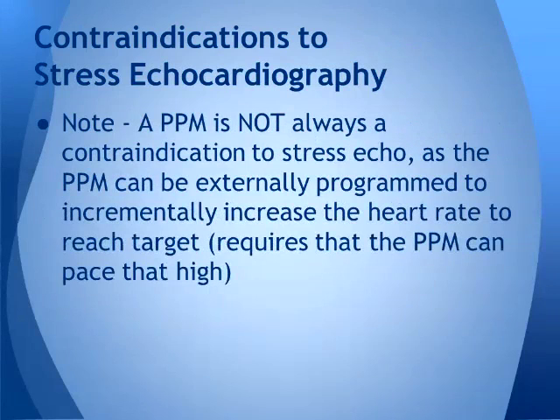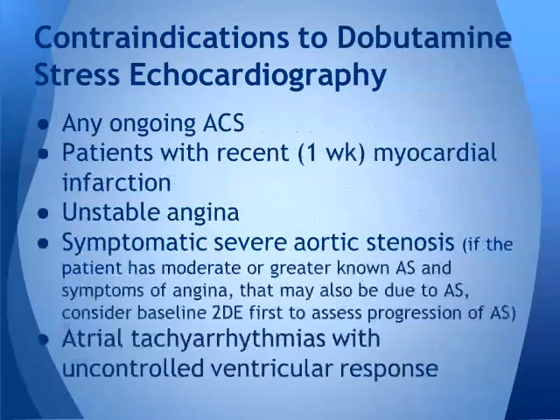Note, a permanent pacemaker is not always a contraindication to stress echo because we can take the programmer and externally incrementally increase the pacemaker to get to target heart rate and do an echo that way. It does require that the pacemaker can pace that high, and not all of the patients are able to do that, but it is a possibility.